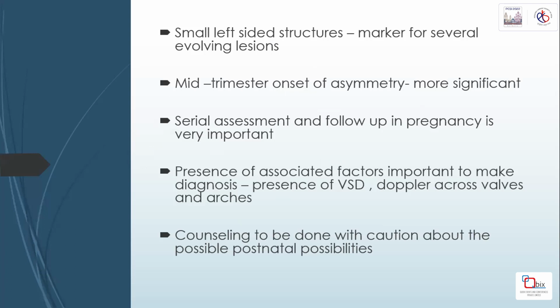Mid-trimester onset of asymmetry is more significant. Serial assessment and follow-up in pregnancy is very important, and presence of other factors like presence of a VSD and the Doppler across the valves, the arches is very important. And counseling is to be done with caution about the possible postnatal possibilities.